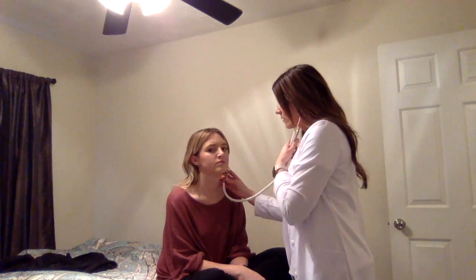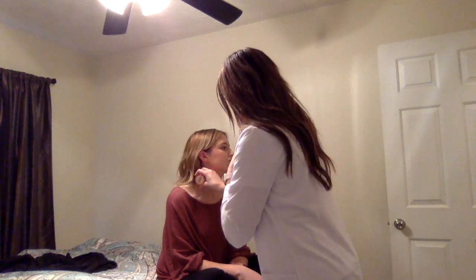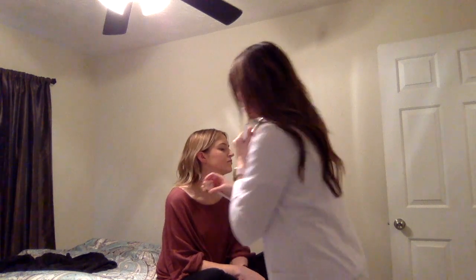Okay. And the next thing I'm going to do is I'm going to listen to Chelsea's carotid arteries. So I'm checking for bruits. I'm going to do it one at a time with the bell of the stethoscope. Okay, it might be a little cold here. No bruits are noted. Okay, next we're going to move to the upper extremities, the chest and lungs.